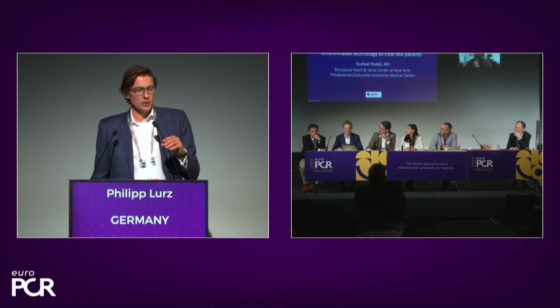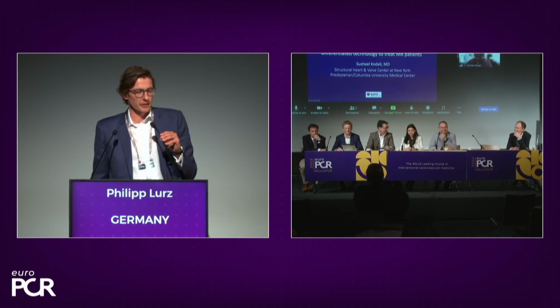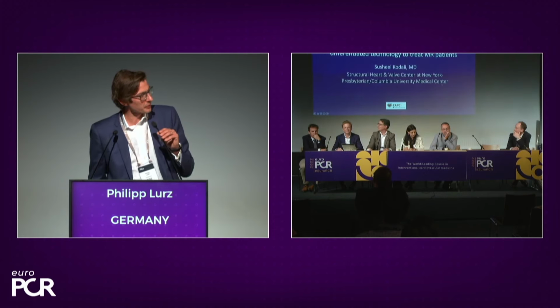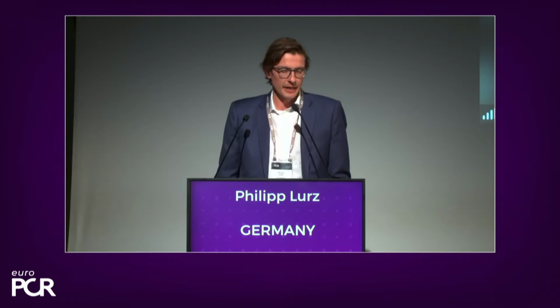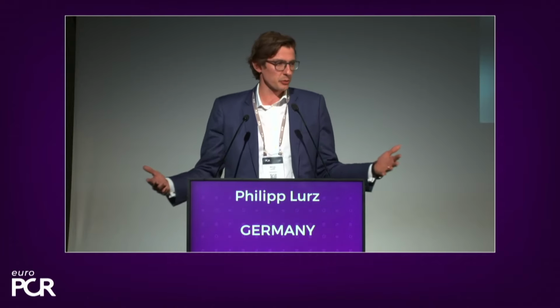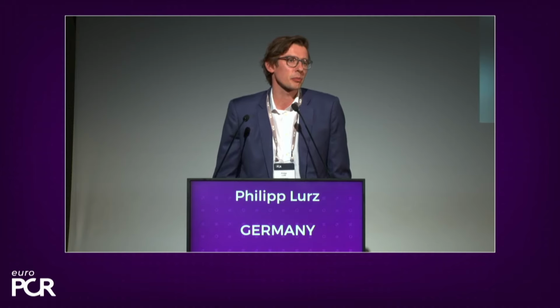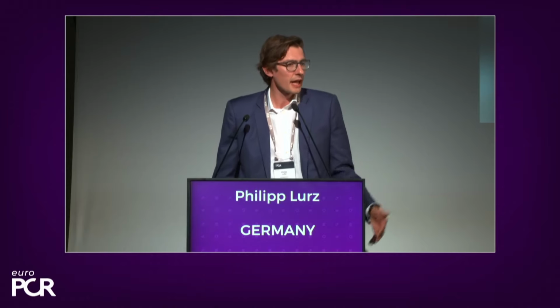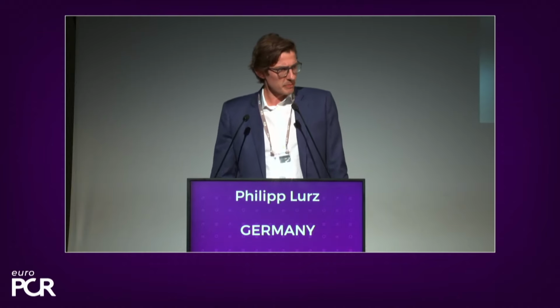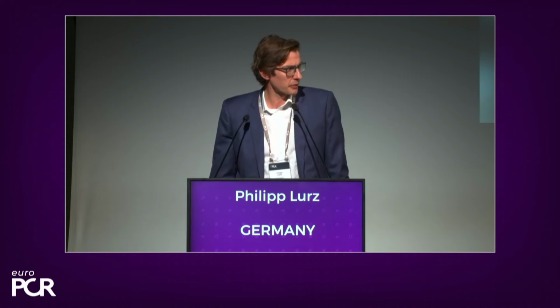Okay. I could share more details with you, but first we will see more details during the case, and secondly we had to make a decision with the information I presented to you, so it was also not any clearer for us. You could argue whether you should bring the patient back, do another TEE, bring everyone into the same room, or use the images we had. I do agree we had some discussions about what the exact pathology was, but obviously it was degenerative, commissural, and medial, the risk was high for surgery, and this is why we were relatively optimistic, or at least we thought it was a good idea to try to treat it with a Pascal implantation.